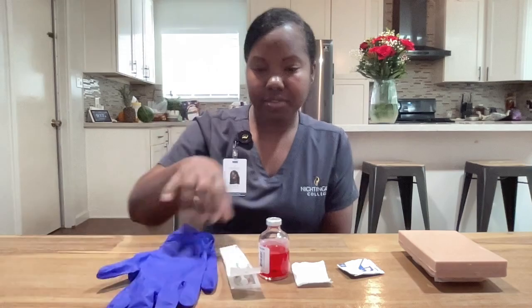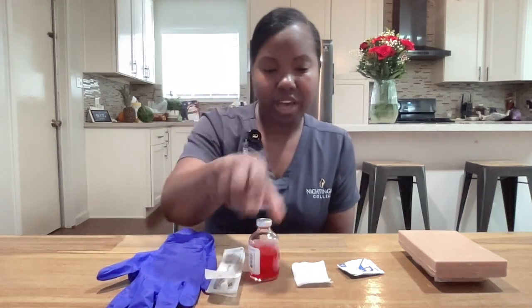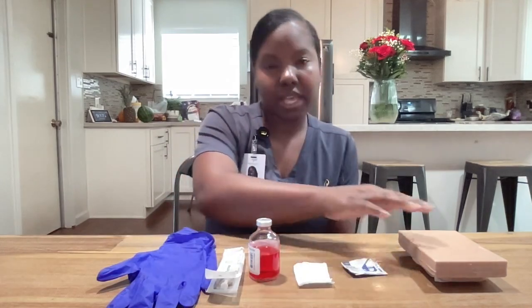Hello, my name is Michelle Nguyen. Today I will be demonstrating the intradermal injection. The supplies I'll be using are gloves, syringe, medication valve, gauze, alcohol swabs, and my patient.